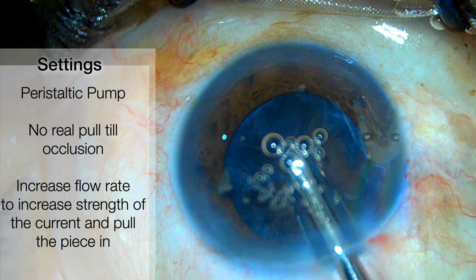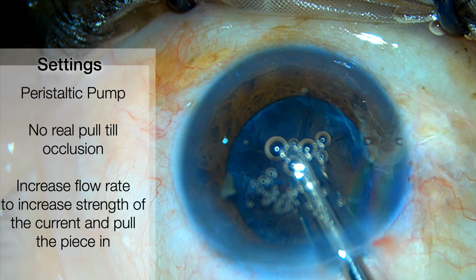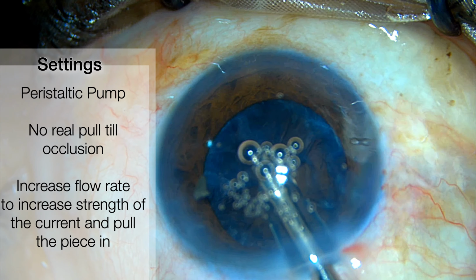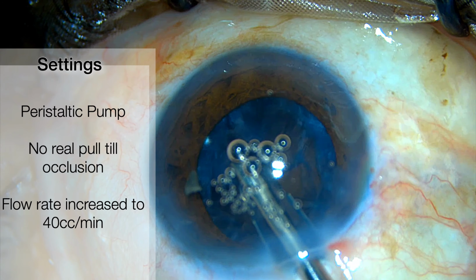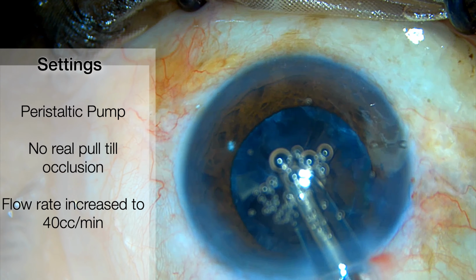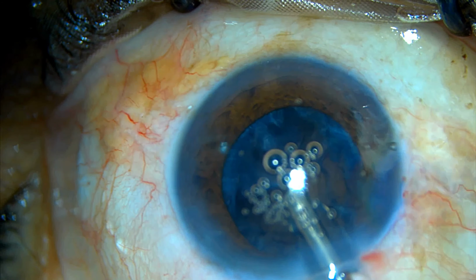The only way to move the piece in a peristaltic system would now be to increase the flow rate, which strengthens the fluidic current in the AC, and that current then pulls the fragment in. And so as you'll see, I increased the flow rate from 29 to 40, and that was enough to pull the piece in without having to come out of the eye, inject visco and burp the piece out.